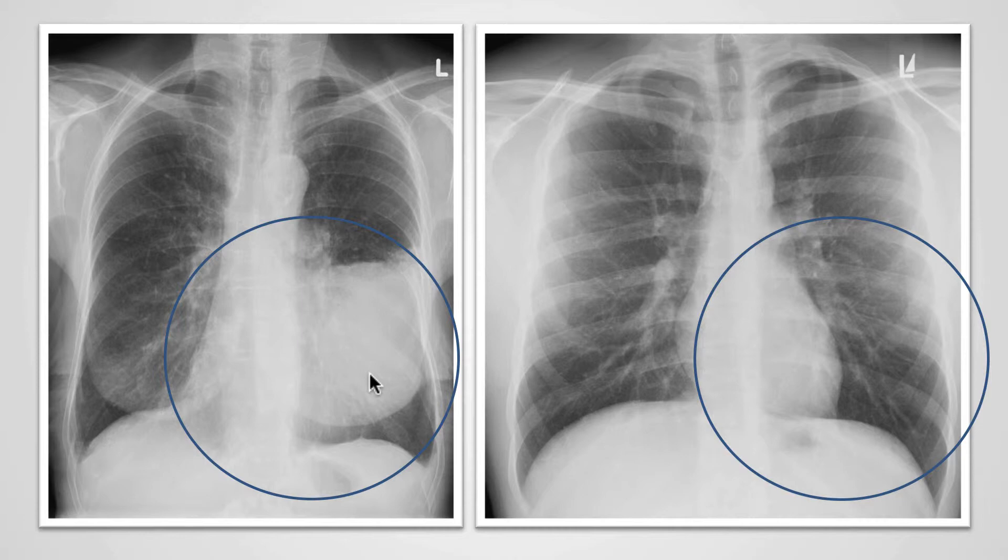This is because this patient has a pneumonia. The pneumonia is soft tissue density and lies adjacent to the heart. Because of the silhouette sign, we only see one structure in this region, which is this white area, the sum of the pneumonia and the heart border.